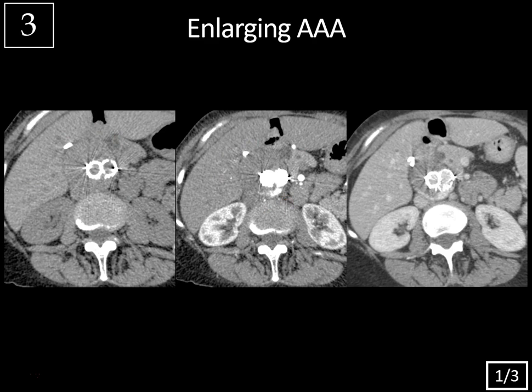Here we're looking at non-contrast, arterial phase, and delayed phase images of the abdominal aorta — a typical multiphase CTA evaluation for endoleak. The non-contrast images show no intrinsic hyperdensity within the excluded sac lumen, and the endograft appears normal. On the arterial phase, there's contrast within the endograft (normal), but also contrast leaking into the excluded aneurysm sac (abnormal). The non-contrast confirms this isn't calcification. On the delayed phase, there's continued accumulation of contrast spilling out into the excluded aneurysm sac, confirming endoleak.